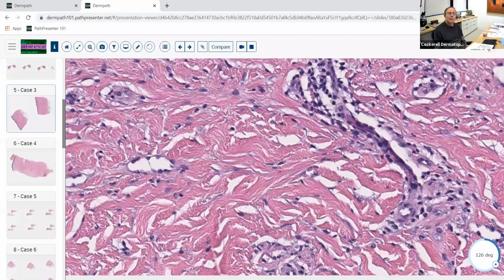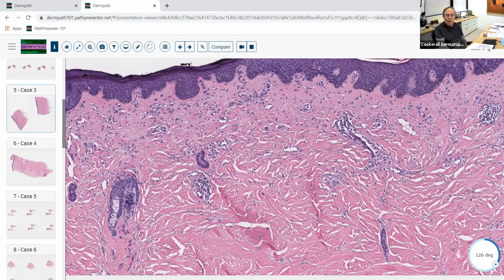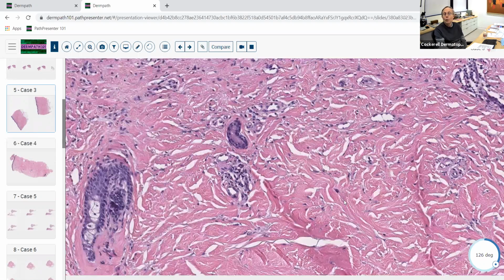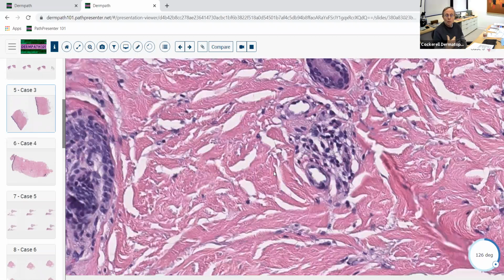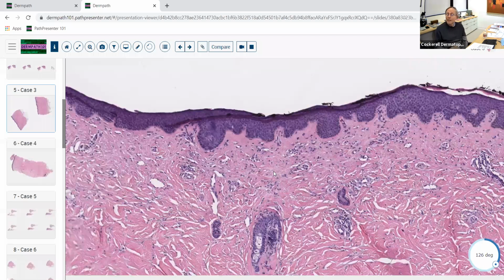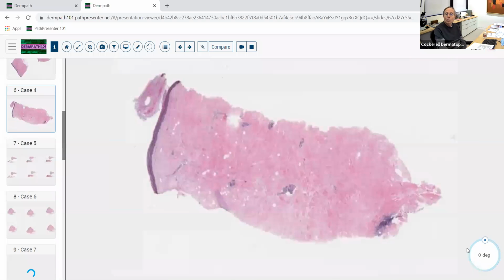One final thing about the sclerosing disorders that I'll mention, I think I mentioned this a couple of weeks ago, plasma cells follow sclerotic collagen. So whenever you get sclerotic collagen, looks like scleroderma, you'll often see plasma cells. You don't have to, but you almost always do. And over here, you've got a few. So again, no one's really looked at that, to see why that happens. I personally think there may be some pathophysiologic significance of it, but it's something that you see in all of the sclerosing disorders.